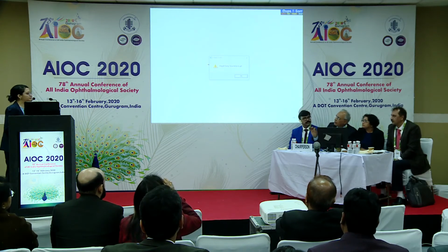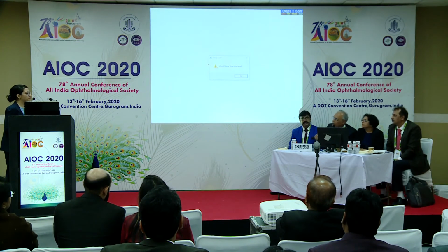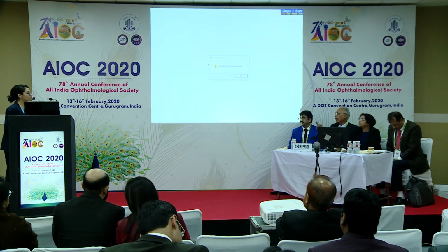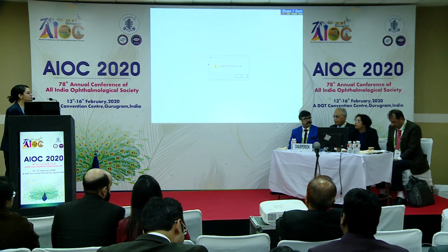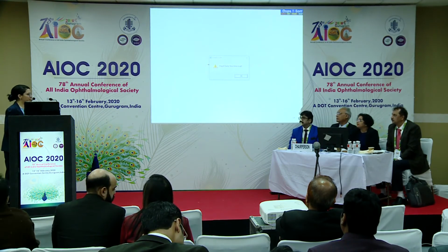Very good observation. But when to do this, as a message for a phaco or a vitreosurgeon? Because he has put in silicone oil, he will wait for the cataract to develop. This is done in cases, sir, if I am a vitreoretina surgeon and a patient comes to me, has cataract, has oil in situ. Is there any role for preoperative measurement of the eye? That's what he means. So the best possible would be to do a preoperative axial length measurement.